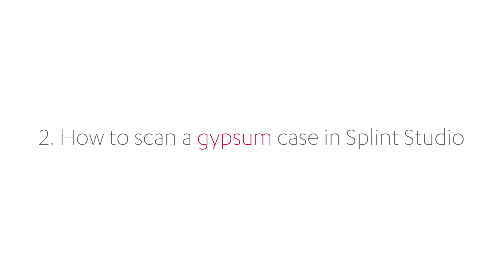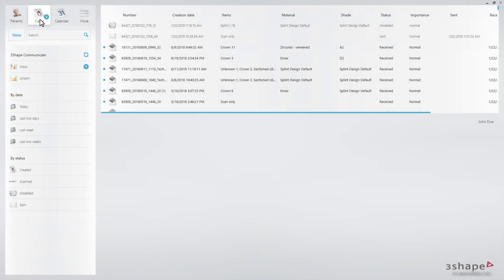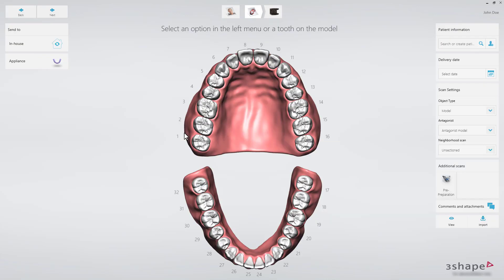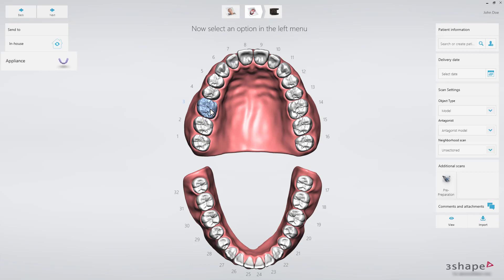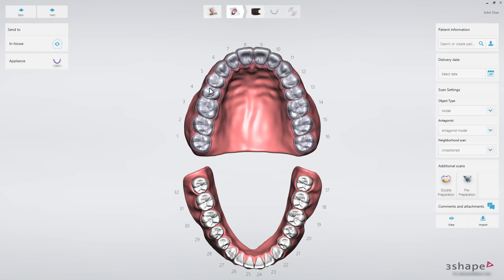Let's scan a gypsum case in Splint Studio. Double-click the icon to open the software and go to the Case Manager. Click New to create a new case. Select In-House. The order form will open. Select a tooth from the jaw that you'd like to make a splint for, and then click the appliance indication. Now you can search to associate the new case to an existing patient, or create a new one.